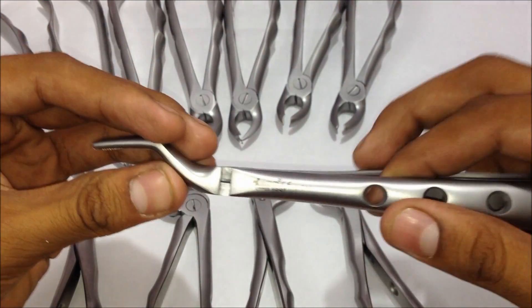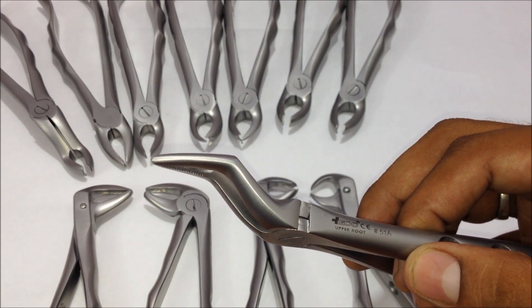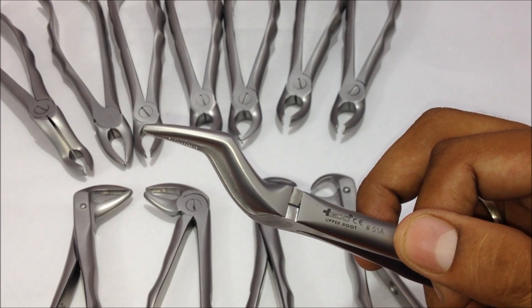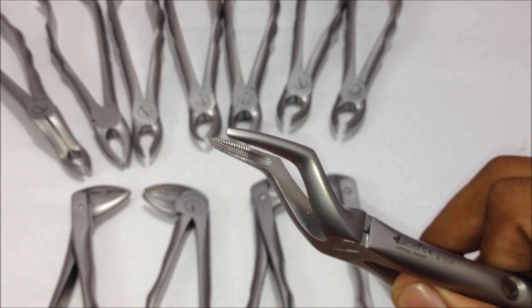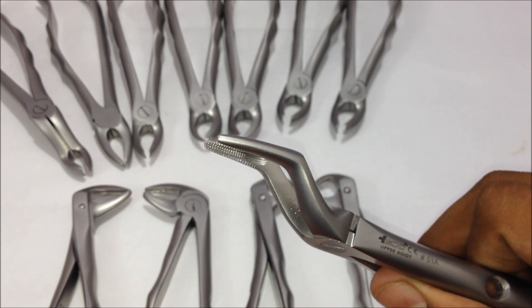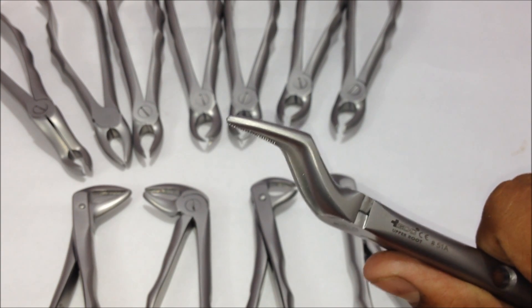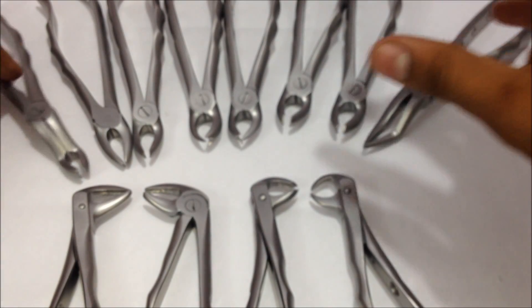This is the upper root forceps, number 51A. Roots are usually left behind after improper extraction of a molar tooth — if a root is curved or bent, it can break off. It has a thin edge at the tip, and the groove area holds the root properly while removing it from the upper, maxillary area. In grossly decayed teeth where the crown is fractured, each root can be separately removed using this 51A upper root forceps.